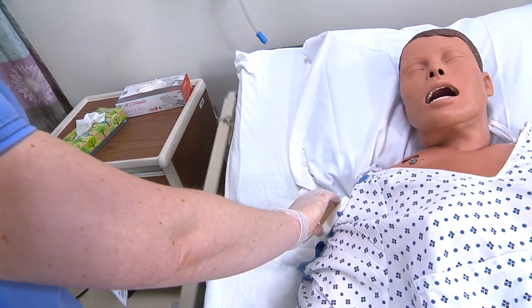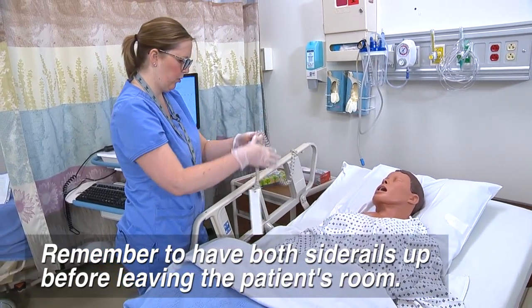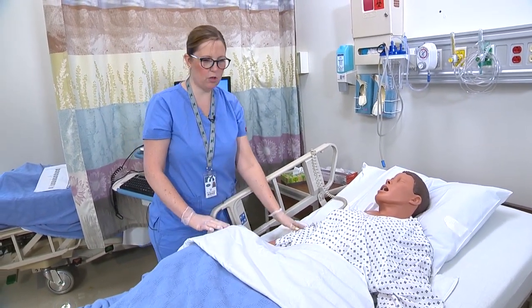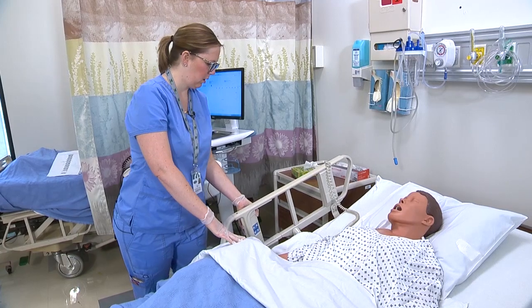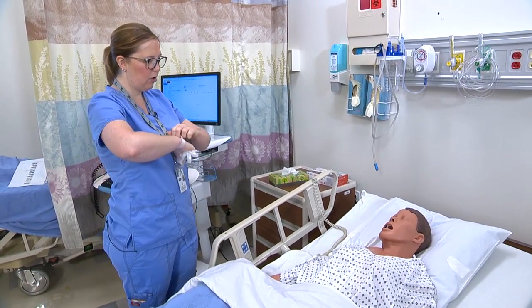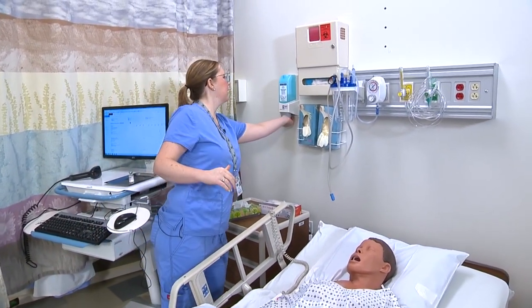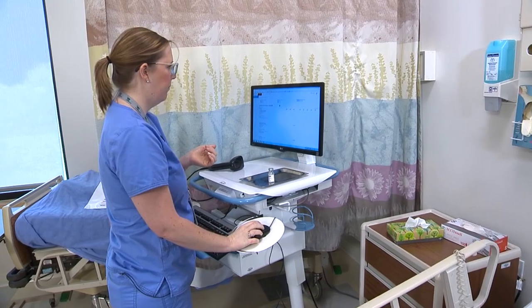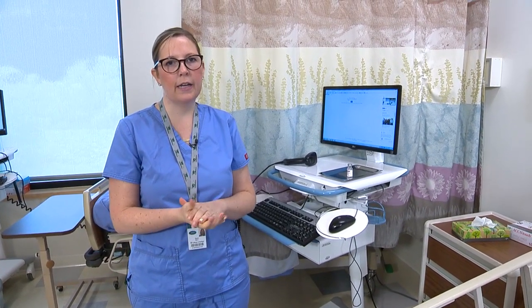Okay Morgan, we're all finished. Get your side rail back up — your arm will be sore for about a day or so. Don't be afraid to use it; it's actually better to move the arm rather than stay stiff. I'll put your bed down and I'll be back to check on you to make sure the site looks okay and there's no reaction. Call me if you need anything sooner. I'm going to wash my hands, and always remember to log out of the computer before walking away. That completes our skill of IM injection.